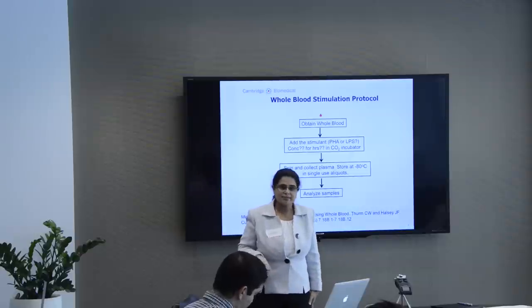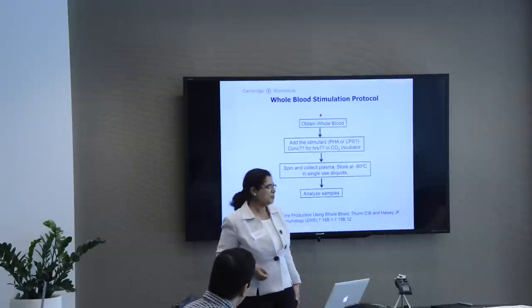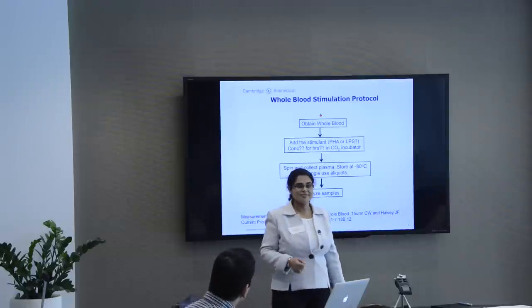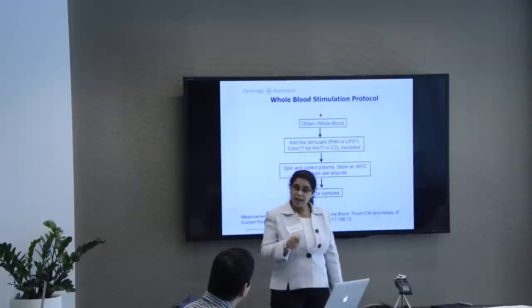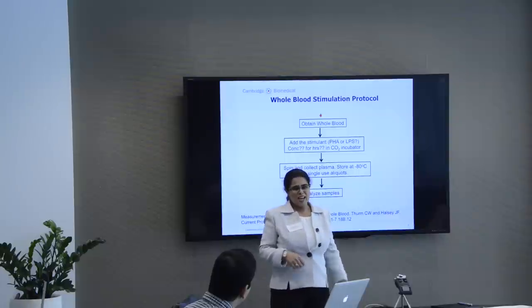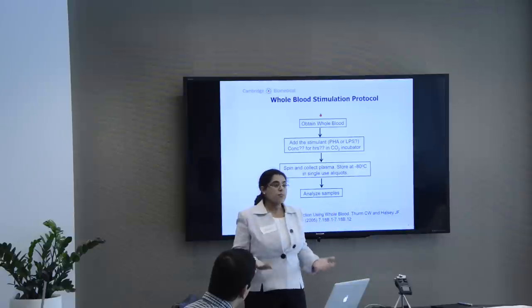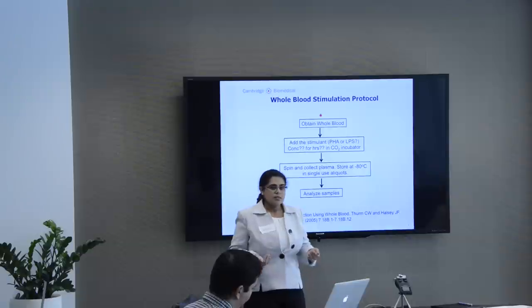Yes? I have a question now. Can you just find the recombinant protein? Yeah, good one. We tried it. It works. You know the problem is? You cannot do a freeze-thaw on them. So your intra-assay is going to work perfectly. What is going to fail is your inter-assay precision and your stability.